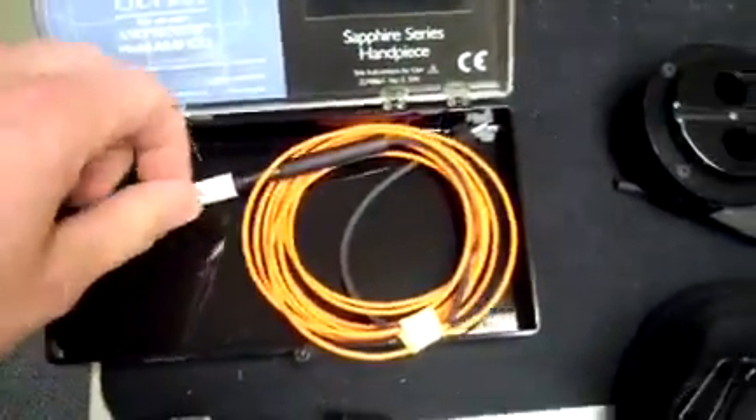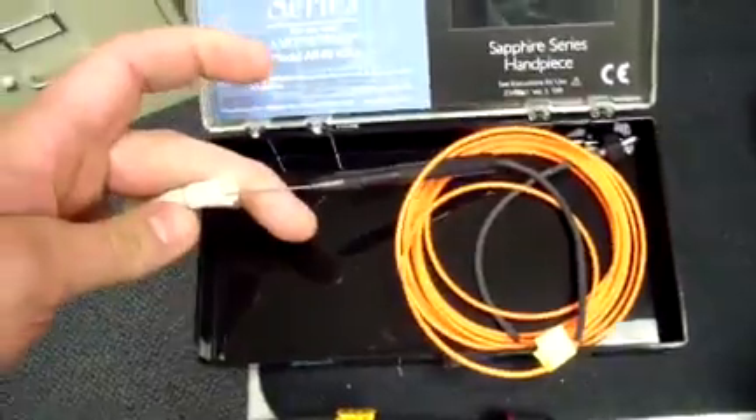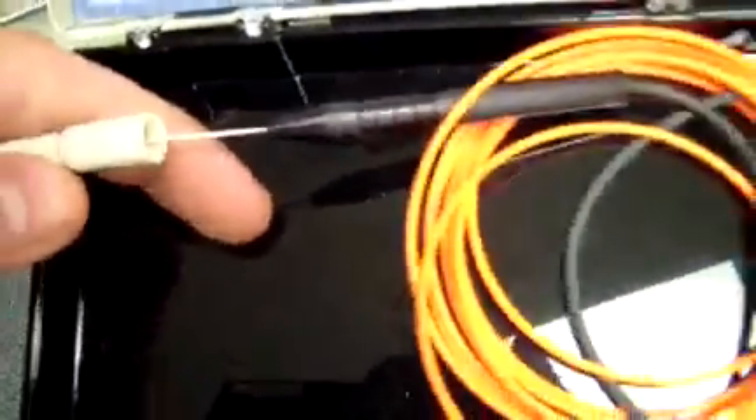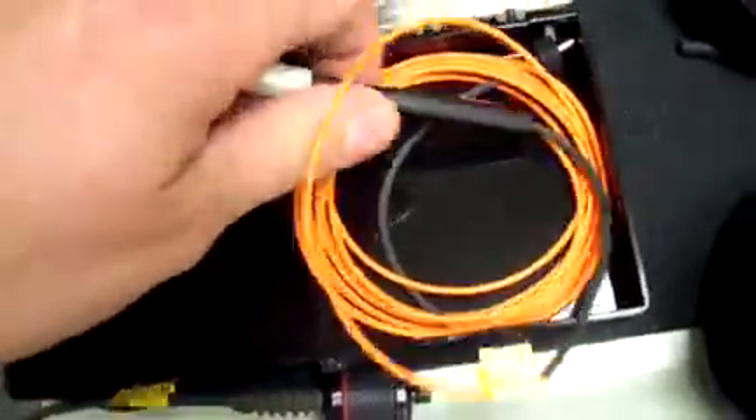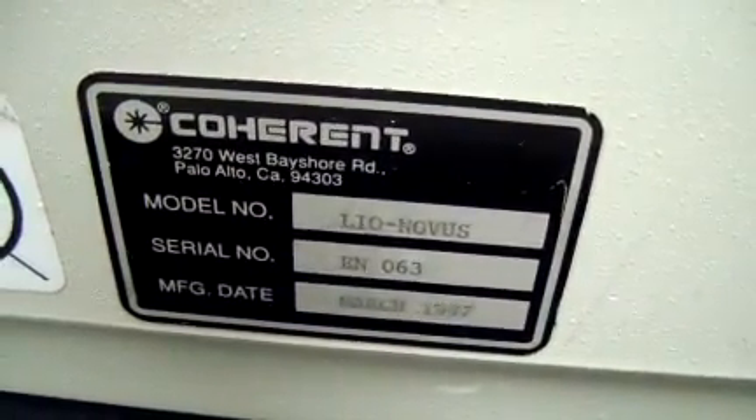There's also one handpiece with it as well. I believe this was just the test handpiece that they had just for pre-case. It also comes with an indirect, and the indirect is actually in really nice condition.